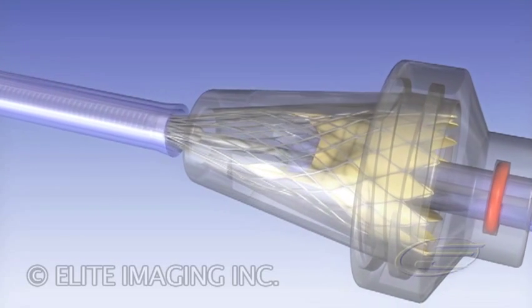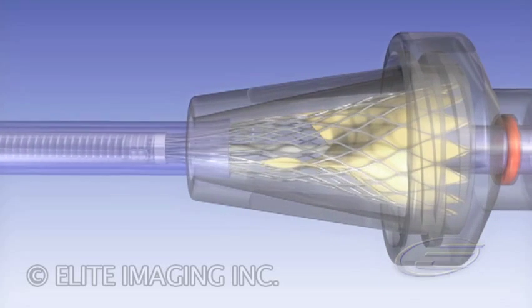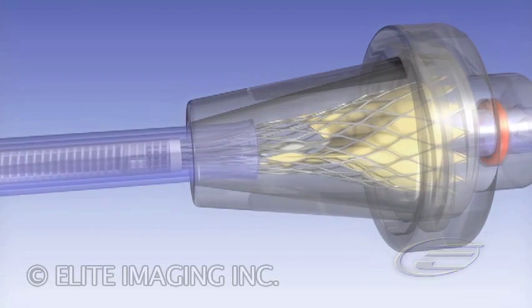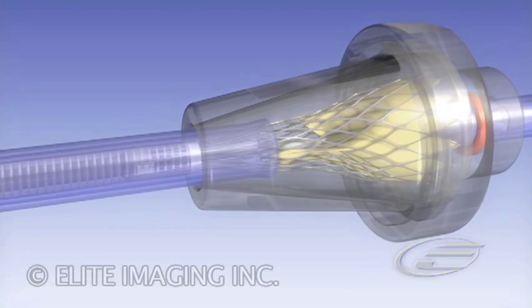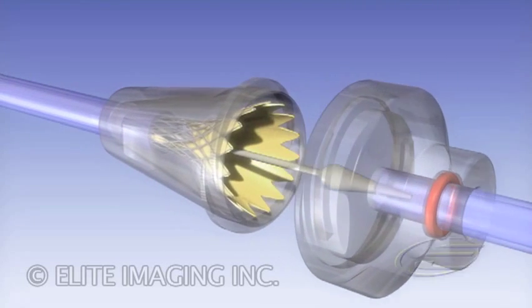Continue advancing the sheath and check that all frame tips are securely covered inside the sheath. Advance the outflow tube tapered over the frame. Remove the outflow cap and inflow tube.